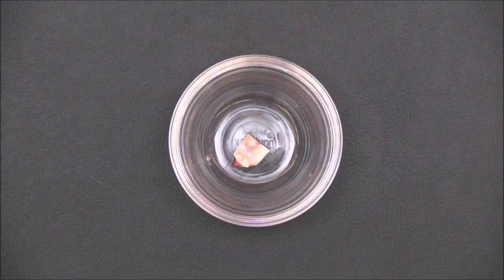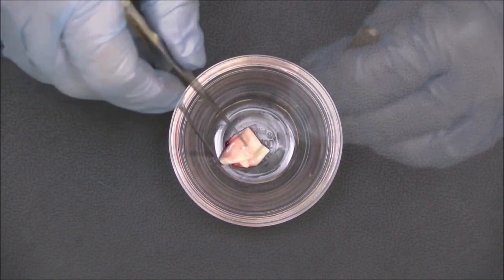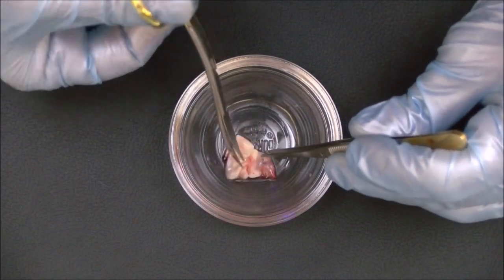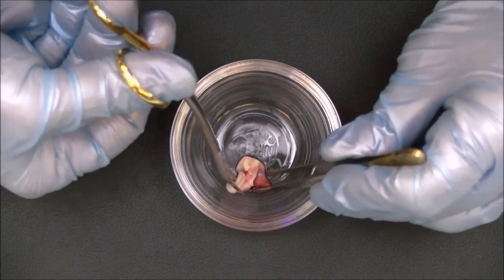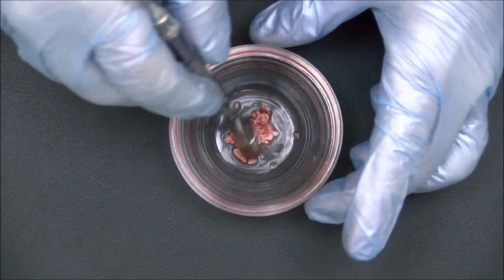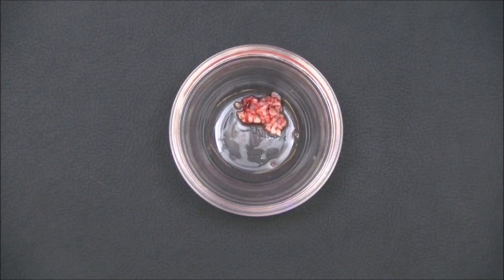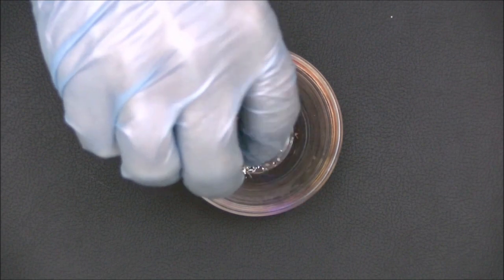Some of the membranes are then delivered to a sterile dappen dish. The membranes are then cut into small pieces, which allows more even distribution of the PRF within the graft material. The morselized PRF is then placed to the side of the dappen dish, and the bone graft material of your choice is added.